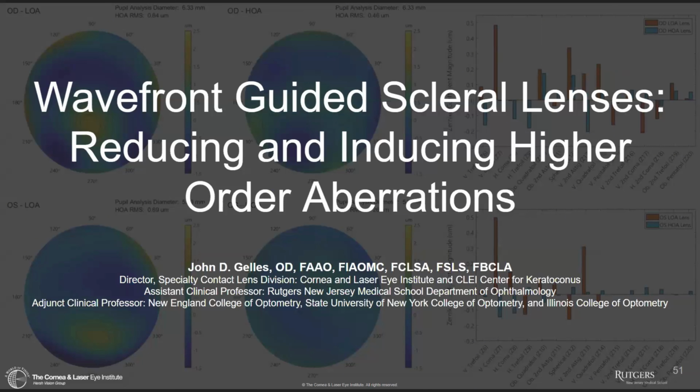Okay, doctor. Dr. May Bakar is asking, since severe dry disease causes dynamic high order aberrations, HOAs, due to tear film instability, can scleral lenses such as those using Ovitz's technology effectively control these dynamic HOAs, or is the technology currently limited to correcting structural HOAs that arise from stable optical surfaces like the cornea or the crystalline lens?